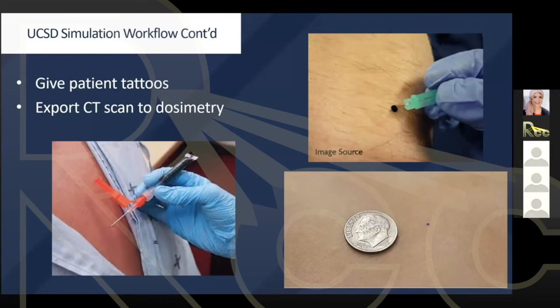What else? Was there any other question on top of that? Regarding dark skin, dark people. Yes, we have a lot of African Americans we treat, and we still use black ink, and we're able to find the tattoos pretty well. If there's any question, you always just take a picture of where it was located on the body, and then you use that picture on day one of treatment to find it again if it's difficult to find.